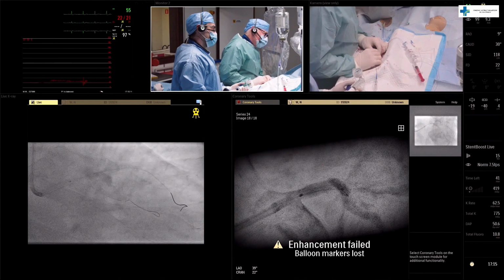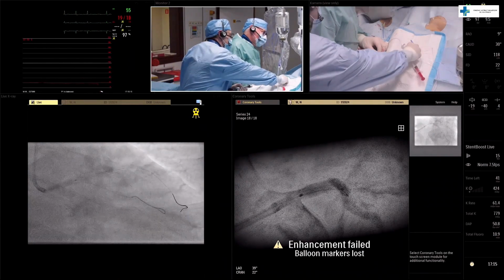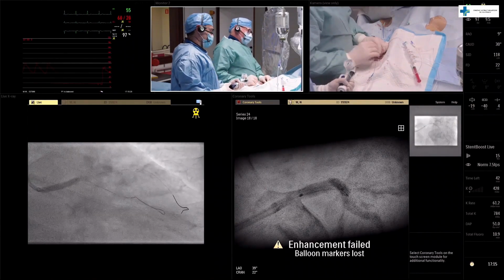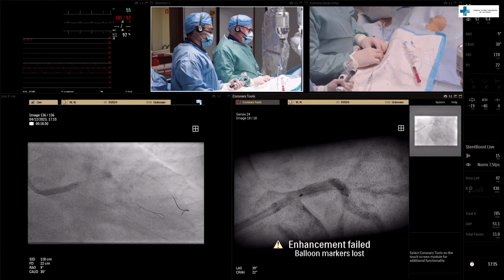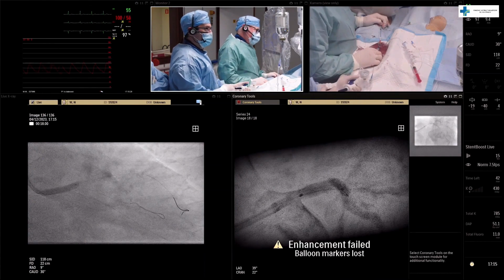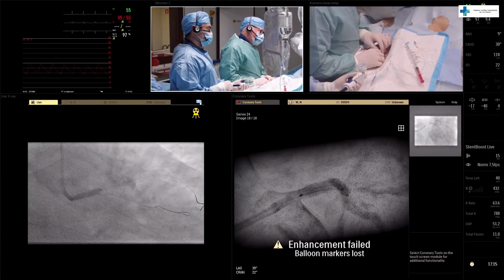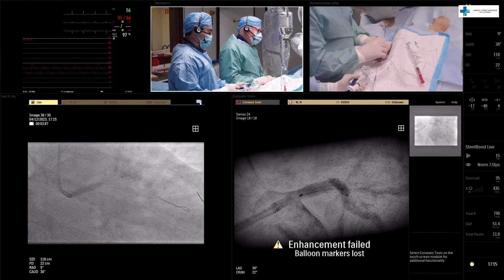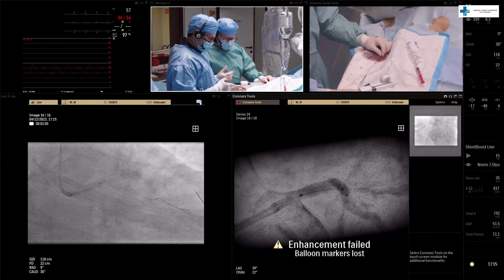And now, please, Pavel, give 16. We will, of course, do, after rewiring, high pressure post-dilatation. But now, not to compromise the circ, 16, 18 with 3.5. And we would go immediately, deflate, with a 4.5 balloon for proximal optimization technique. So we need to wait for full deflation of the balloon before we go back. Otherwise, we increase the risk of stent distortion.